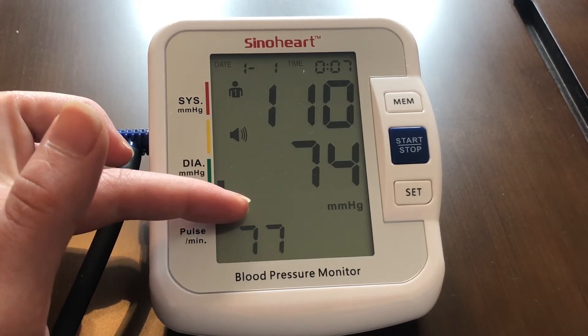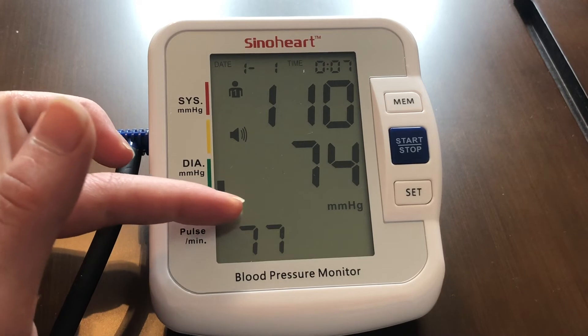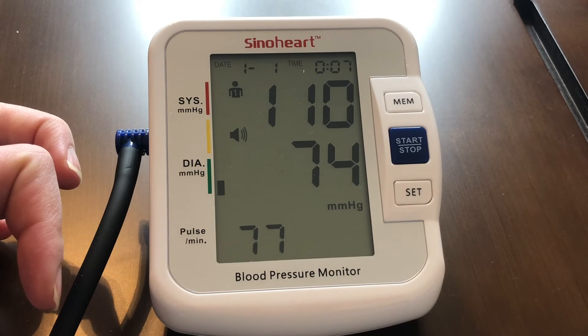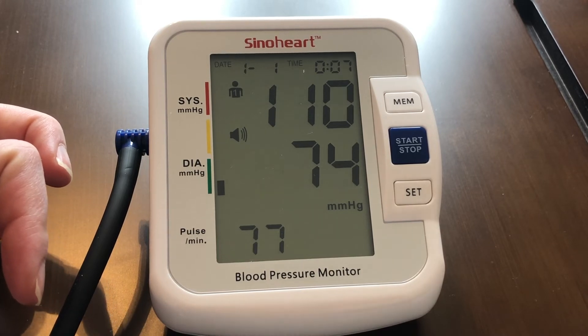If you do have arrhythmia, this is a really important feature — it will show three hearts, which means that you will need to go to the doctor. Early treatment is the best treatment.